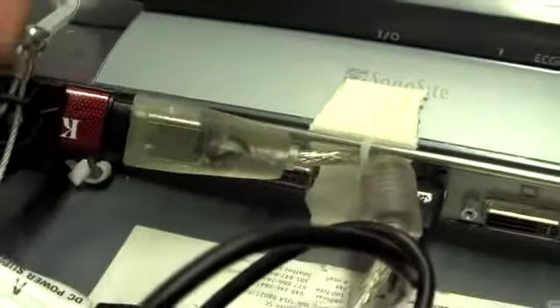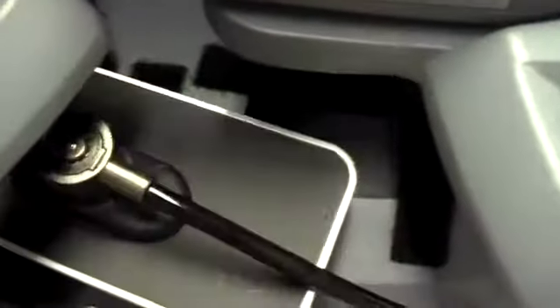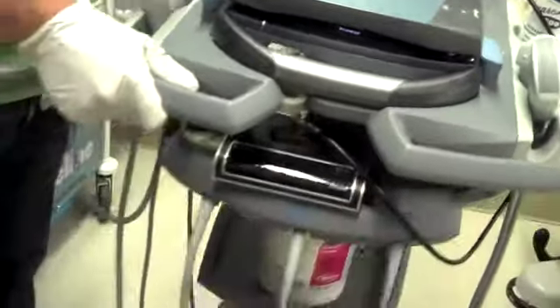And then on the recording device aspect, the S-video has to be snug coming into the device, and then the power supply, it's kind of hard to see it right there, but the power supply is also coming into the device, and the USB extension cable is coming out the side. So it's a lot of stuff to troubleshoot, but that's always the problem. When someone calls me, they can't get the machine going. It's all those connections have to be snug.